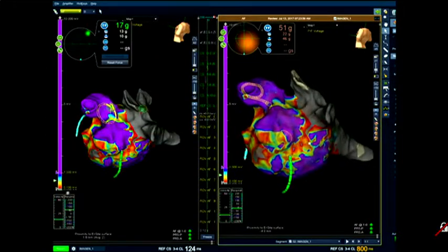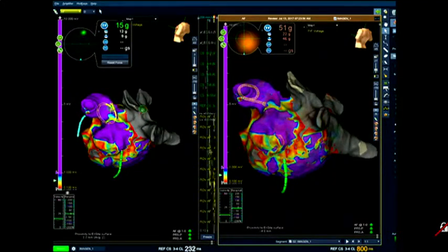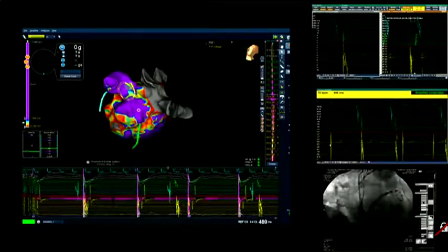We pace, to check whether, yeah, we can do it live actually. Why don't you pace, please? Pace from the lasso. We determined that the mitral line, please give it to us live. The electrograms, please, live. Give us the electrograms live. Give it to us in the live monitor, please. Fermin.